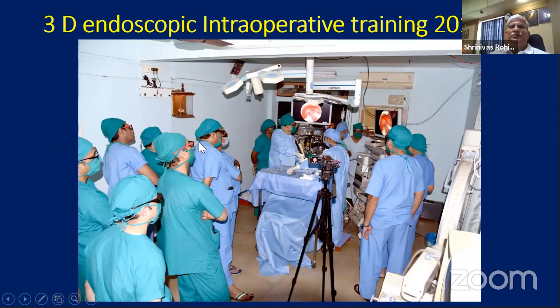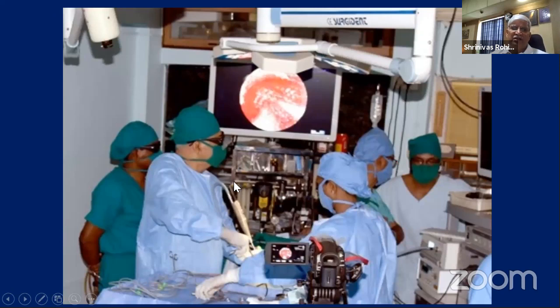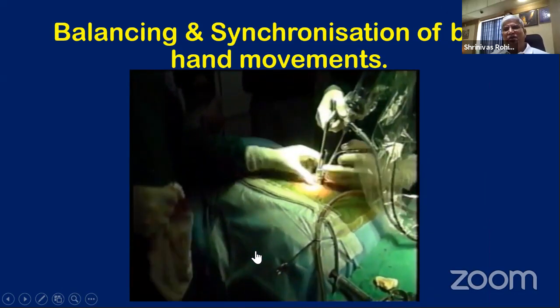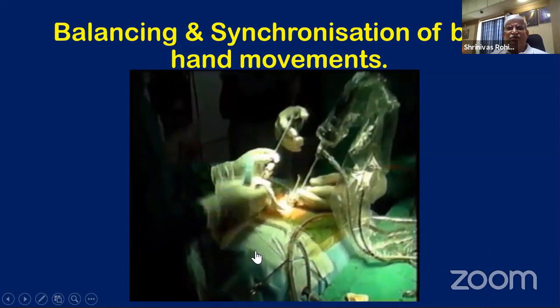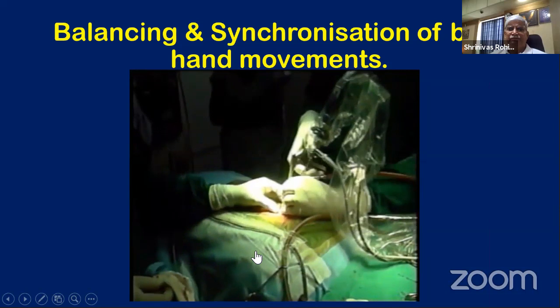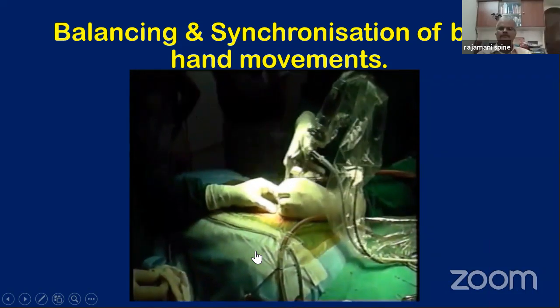And this is now in 2017-18, a 3D endoscope, intraoperative training, and you can appreciate the size of the endoscope here. This is the 3D endoscope by Storz. You can just appreciate the hand movements with the endospine. This was in 2004. The whole system moves together.